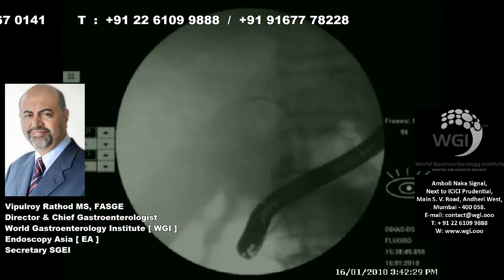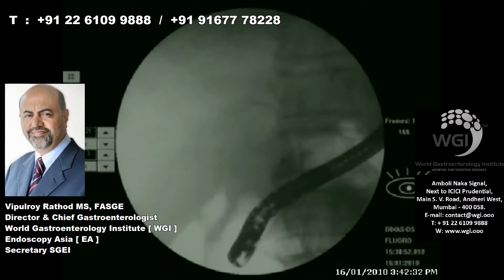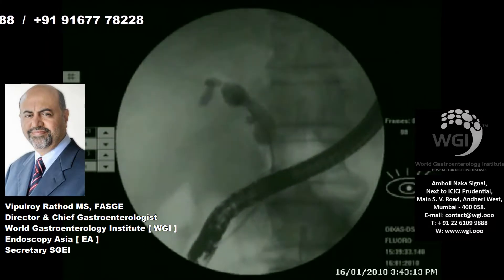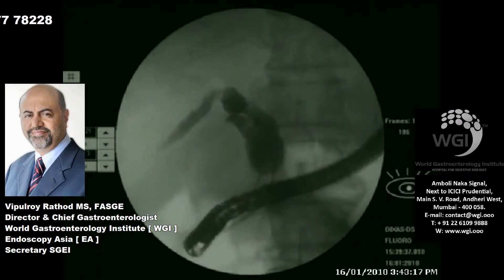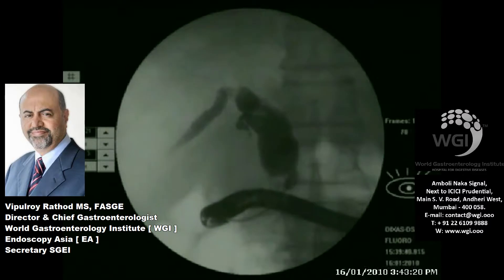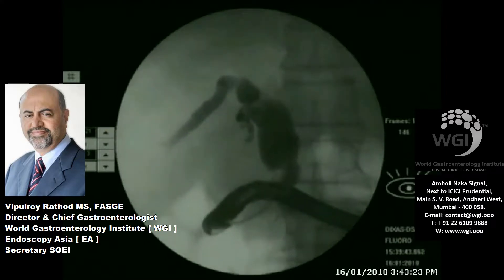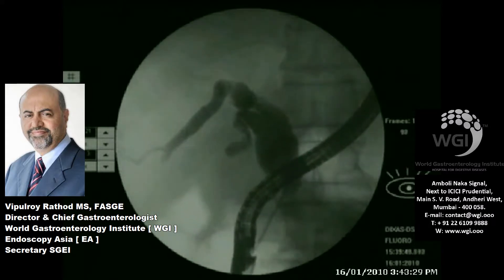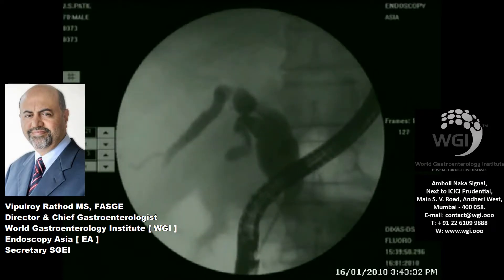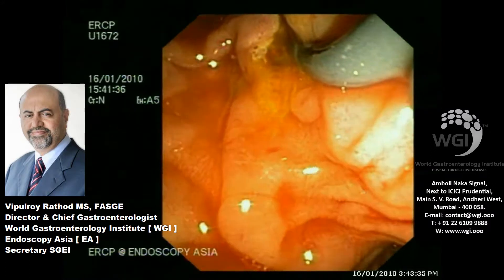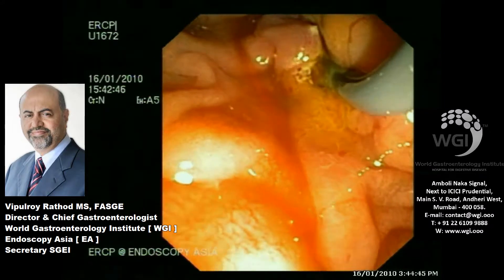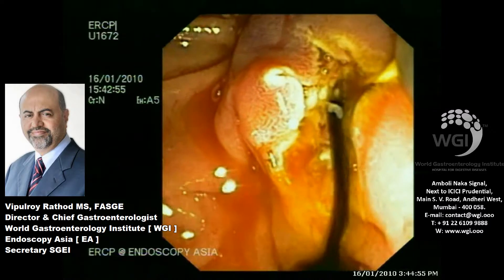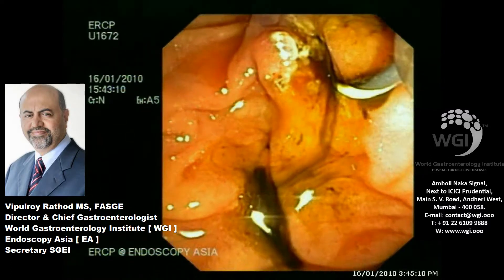You can see that our guide wire has gone deep into the intrahepatic biliary system. We always make sure that we are in the IHBR and not in the gallbladder, and then inject contrast. You can see the entire biliary system with the cystic duct takeoff. It is important to ascertain that you are correctly in the intrahepatic biliary system. We are evaluating the stricture — you can see the lower bile duct completely occluded with the neoplastic process on cholangiogram. We then exchange the Terumo for a stiffer guide wire once we have obtained a cholangiogram. You can see dark bile coming out.